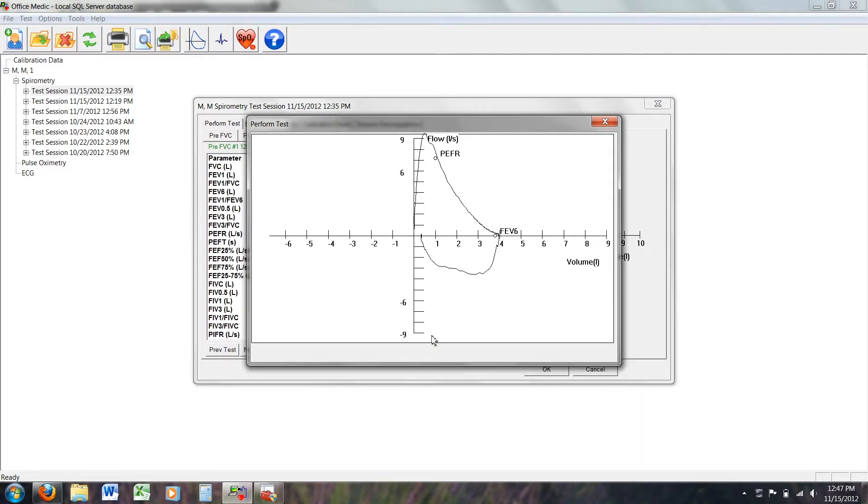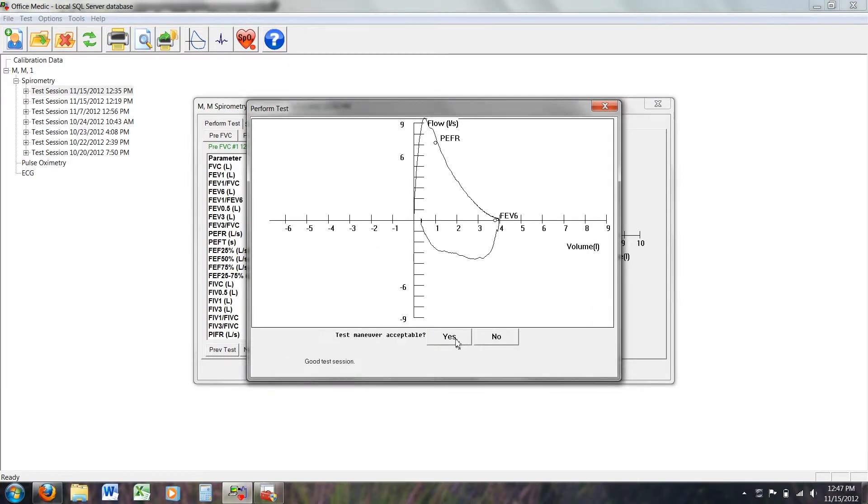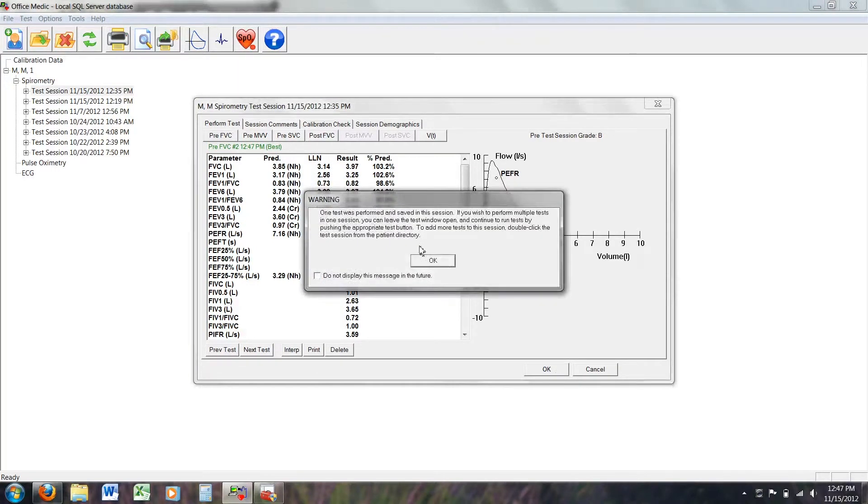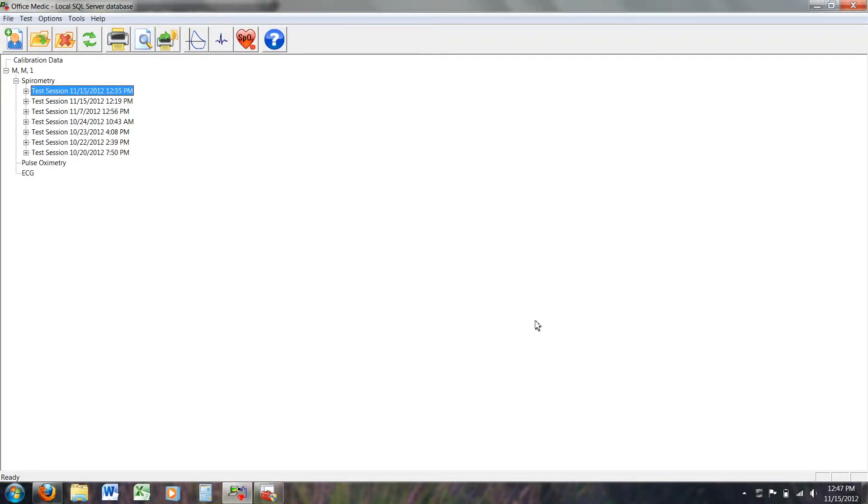On your screen appears your flow loop, a graphic representation of the test — a complete breath cycle. You can also see all the data from this test: predictive values, actual values, and the percent your actual values are of the predicted values — essentially how you compare relative to the normal for your demographic. You can also test your pulmonary function after using a bronchodilator, and the software calculates changes in all the data points.